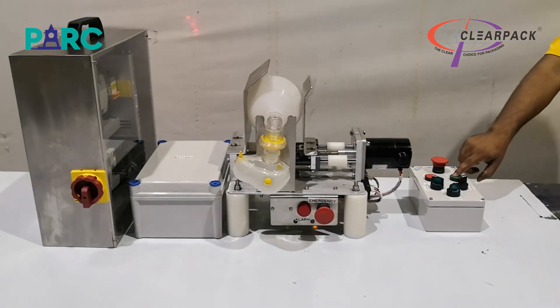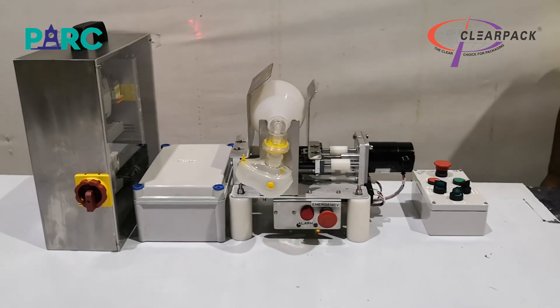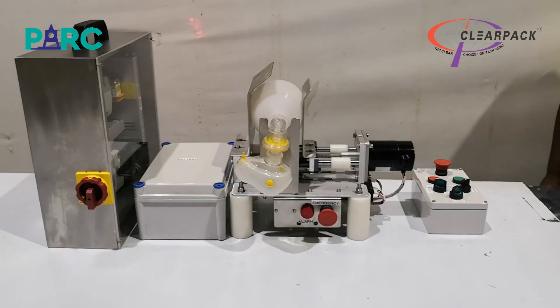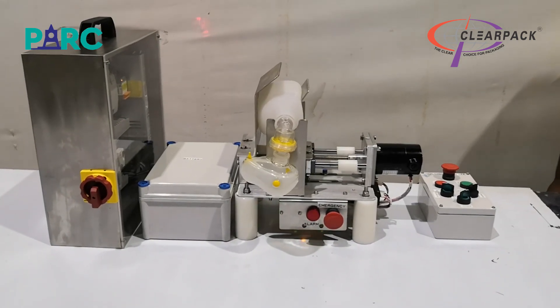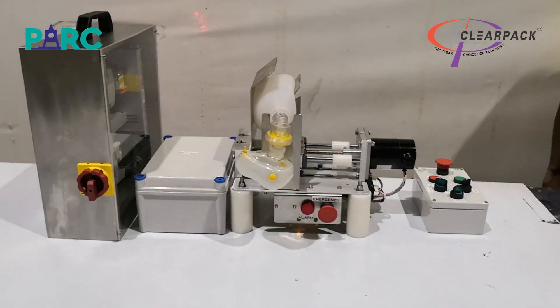We have developed the Respimatic 100 as a low-cost respirator for use in emergency situations where a ventilator is not available. This provides the basic functions required to assist a patient who is not breathing or breathing inadequately to inhale and exhale.